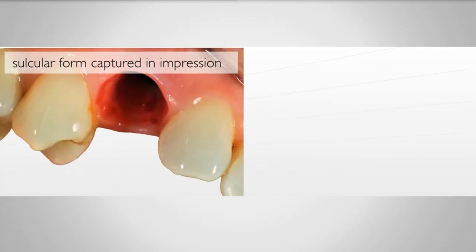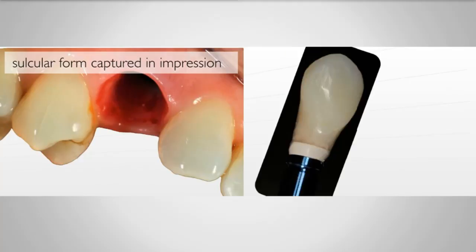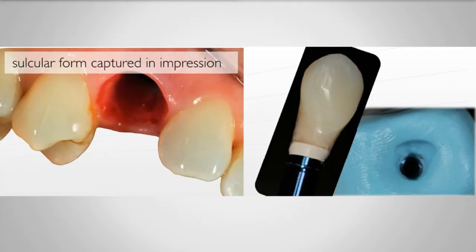If you want to, you can place a healing abutment in here because the tissue will collapse a little bit. I'm then going to attach an analog to the provisional restoration. This happens to be, again, a Biomet 3i. It might be hard to see on your screen, but this is their blue analog for the 4.1 millimeter certain platform. I have my assistant mix silicone putty, and I'll take this whole assembly and just plug it into the putty. This is actually her contour after I've taken it out. You plug it in there, allow that to set. This is just another way to do it. There are many ways to do it.